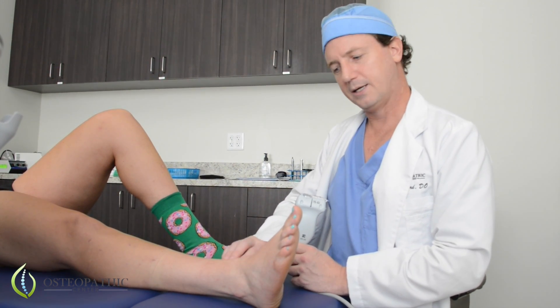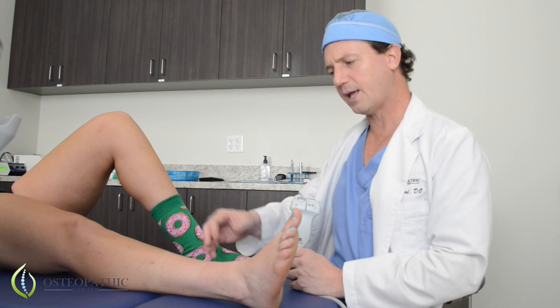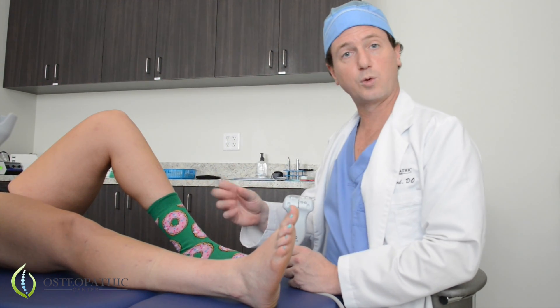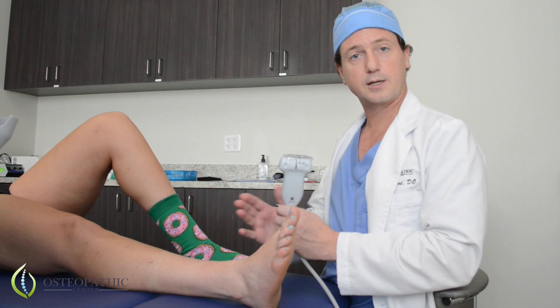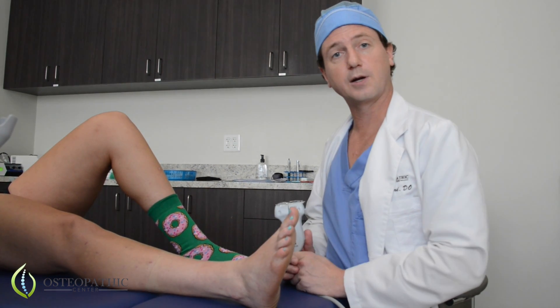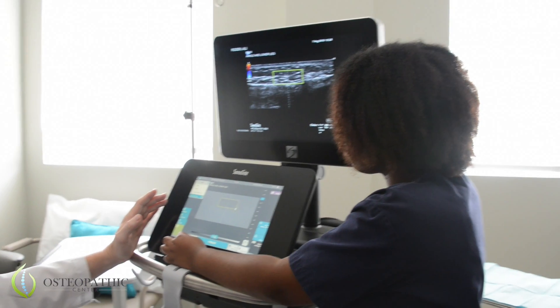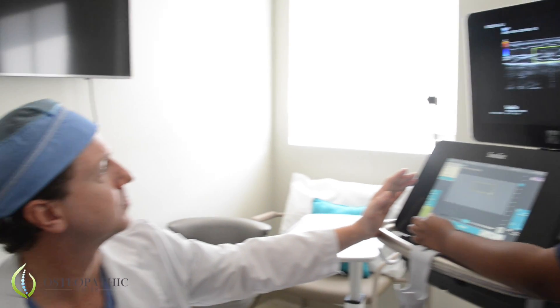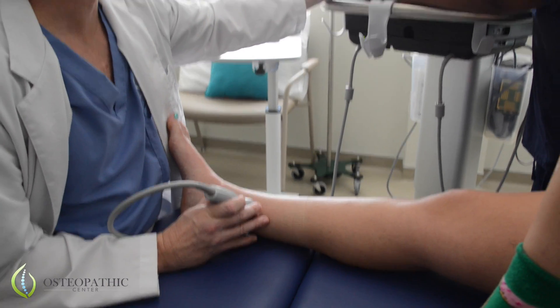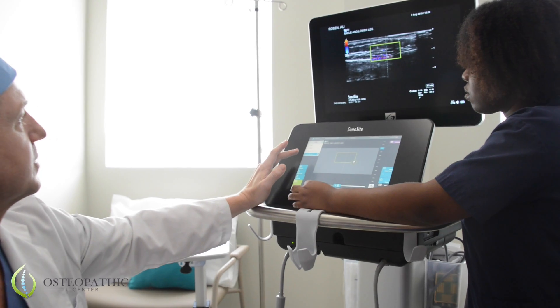The pain is at the medial malleolus on the inside of the leg and traveling up. I've already felt some tender spots in here and it feels like it's partly the soleus and gastroc overlapping. I'm going to look at it with ultrasound to figure out what we see and whether anything could be more severe. I'm looking for fluid, looking for vessels — right across the middle this shows the bone, and I don't see any disruptions in the bone.